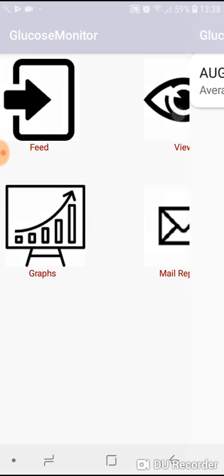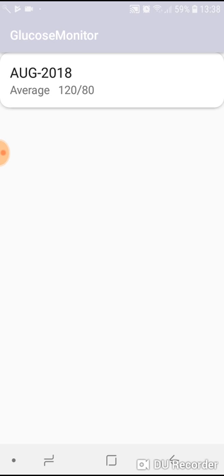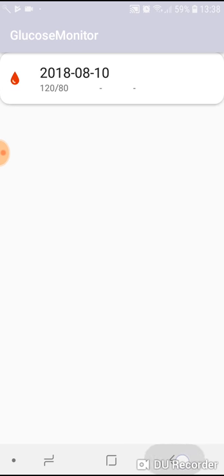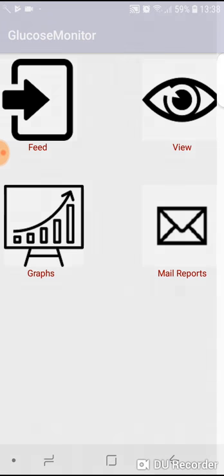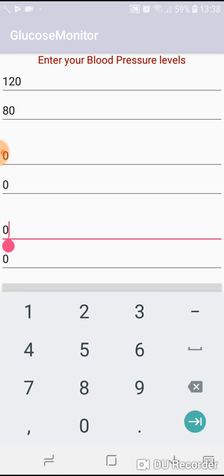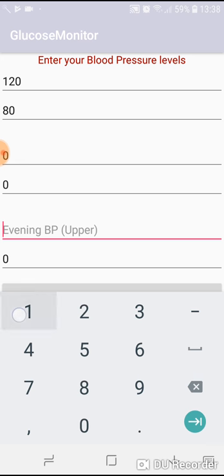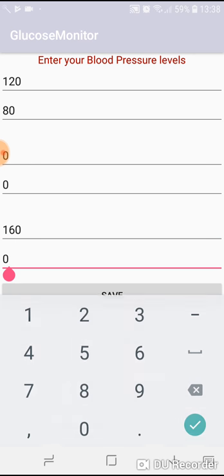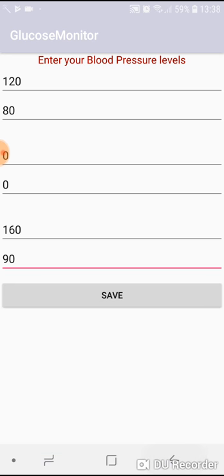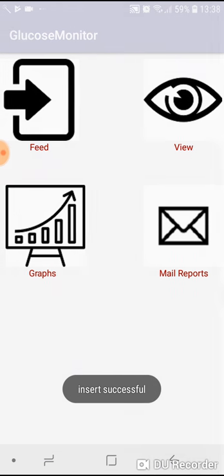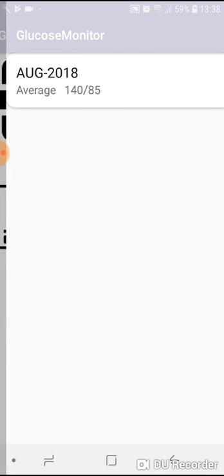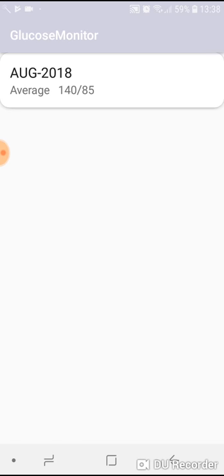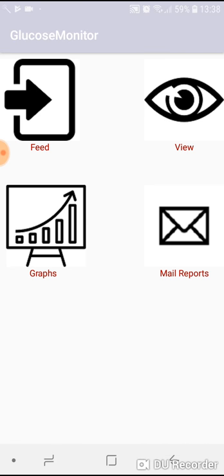If I view it, in August the average was 120 by 80. Again for the morning the average was 120 by 80. If you feed the value for the evening, for example let's say 160 by 90. Let's see.